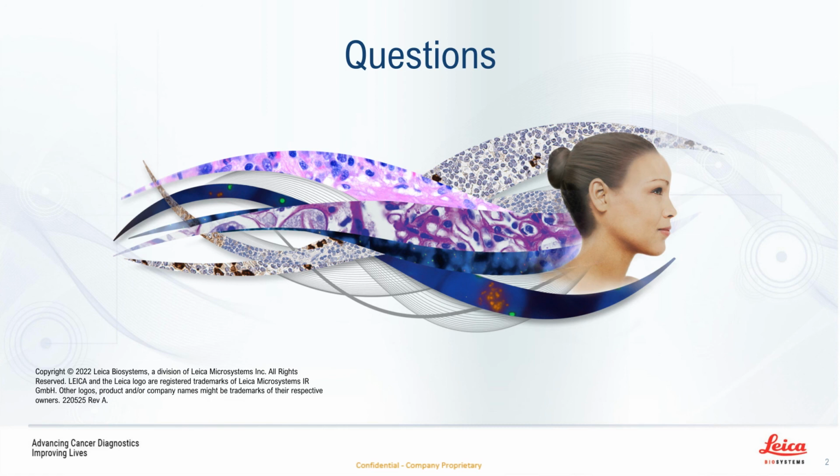I think when you're adopting digital pathology and looking at specific use cases, and I didn't really touch on this during the presentation, but it raises a very good point, which will be to actually look at your sample types that you typically have within your lab and work out what the standard scanning process would be for those slides. So it'd be something to take into careful consideration.